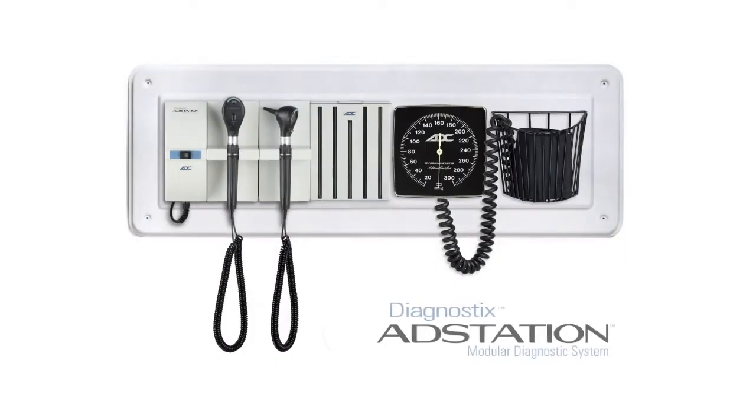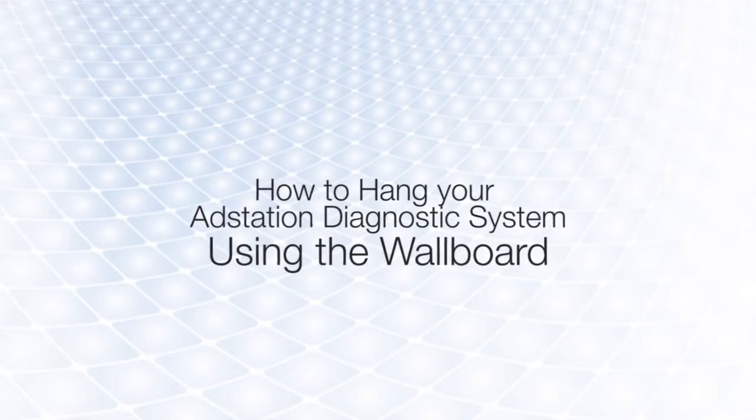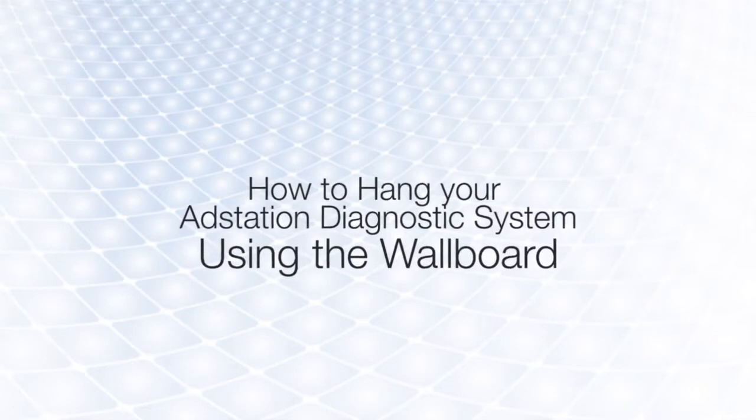The ADC Diagnostic AdStation offers a modular solution for doctors and clinics. Certain models are available with a wall board option, which simplifies the installation process. In this video, we'll review the process of installing the pre-built AdStation wall board on drywall.